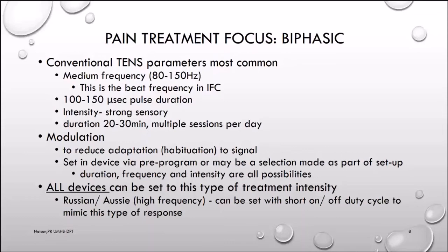My pulse duration should be 100 to 150 microseconds. My intensity should be strong sensory stimulation, and I'll do a 20 to 30 minute treatment, and I can do multiple treatments of those during the day.